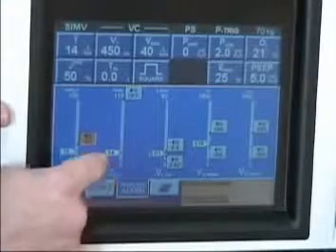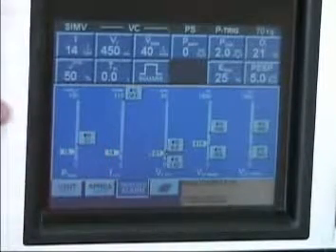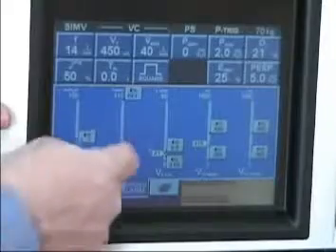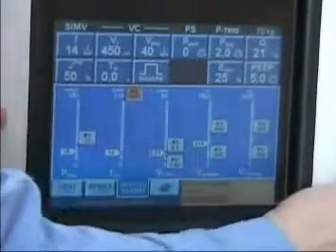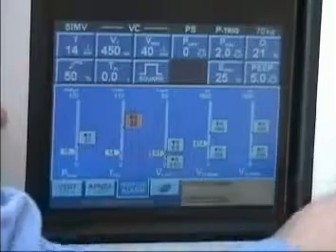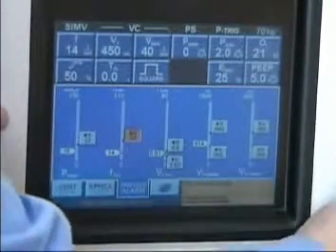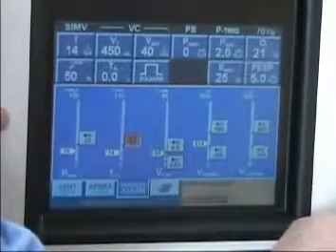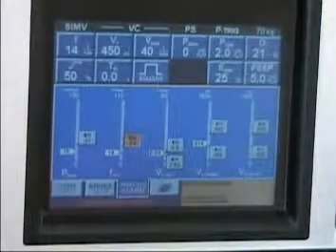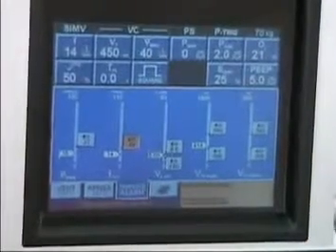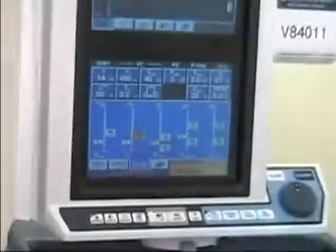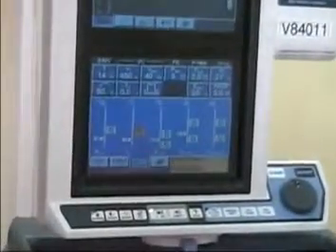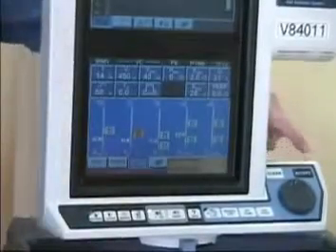Our next is frequency total. If the patient was breathing more than just the ventilator, you would see this number higher. Typically we set the frequency at 10 over what the patient's breathing. It's at 14, so we are going to set it at 24. Now we have to press the accept button.